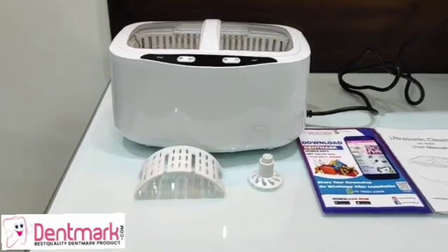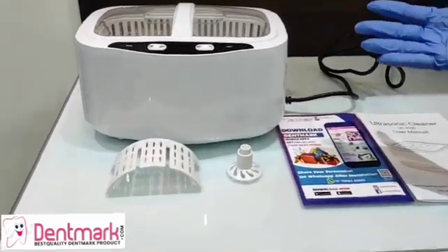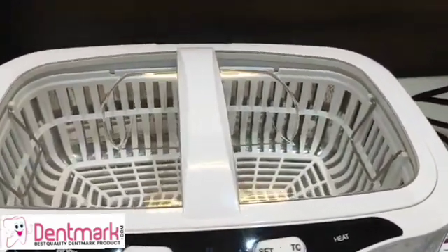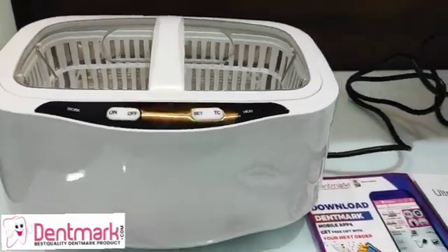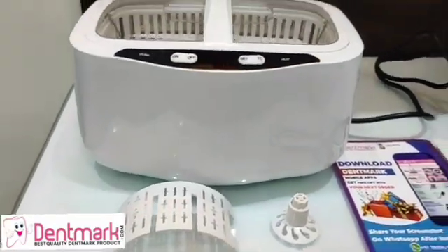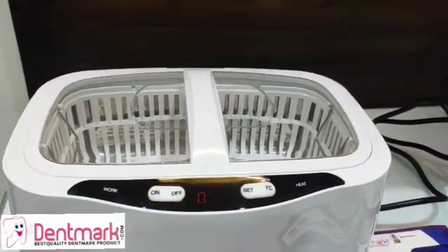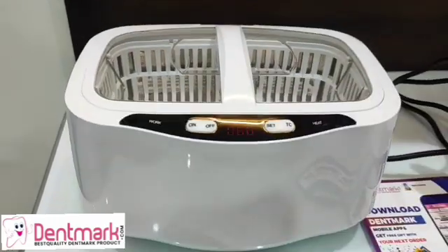Greetings Dentmark viewers. Today we are going to watch a video on the ultrasonic cleaner by Dentmark. This is used to sterilize dental equipment by dentists, but apart from this, many optical shops, jewelry shops, watchmakers, and mobile repair shops also use this ultrasonic cleaner — so it has multi-purpose functioning.